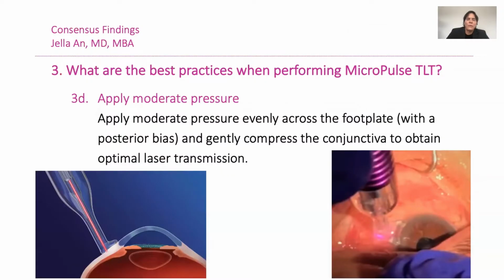And so let me ask you, Mike, what's your favorite coupling agent, and has it changed? So when we did the study, it was actually started because my one partner and I had an argument about whether lidocaine gel, or I was at the time actually just reapplying balanced saline solution frequently, and I had the belief that the lidocaine gel would actually inhibit some of the output. So it was kind of more of an argument than anything else. And sure enough, he was right, I was wrong.